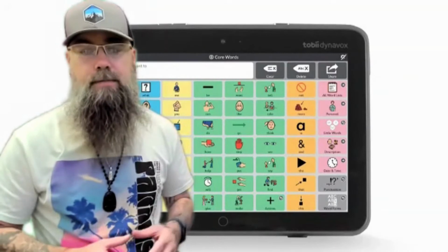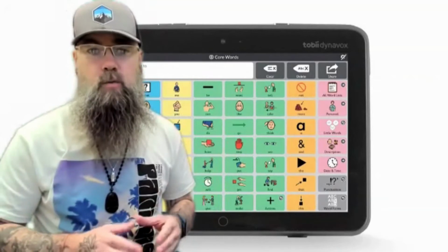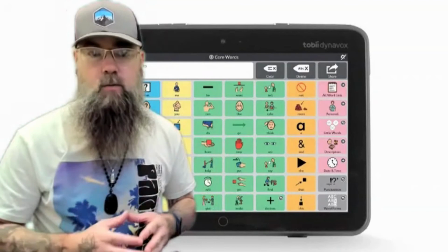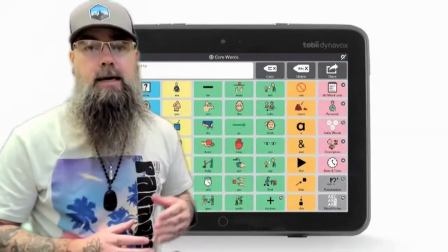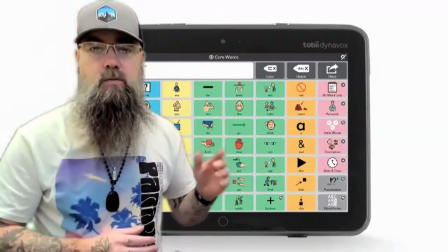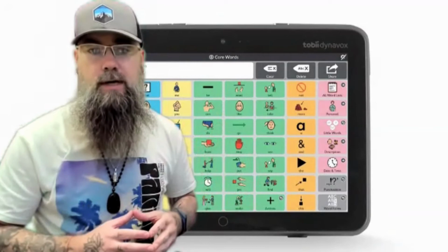The student has the option to touch each section that they'd like to say or use their eyes, and the computer will recognize where their retinas are focusing on. And as they focus on it, it will say the word or phrase that they wish. Now, as you can see with this layout, there is a variety of things that they can say, and different buttons will do different things, such as the green section, which when you press on or indicate on one, expands into other options so you can be more specific in what you're trying to say.